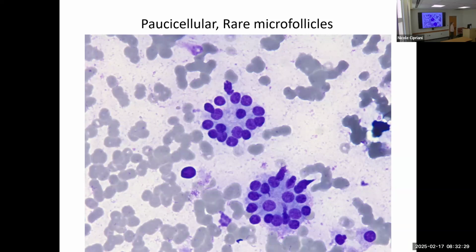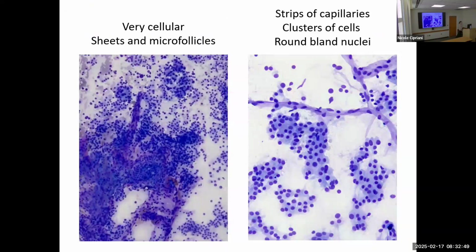This implies that this might be a follicular adenoma, right, or a follicular carcinoma. But this is referred to as AUS architectural, right? So atypia can be nuclear and atypia can be architectural based on whether it's the size of the follicles or the shapes of the nuclei. Or it could certainly be both, right? But these are the patterns of AUS that we have.